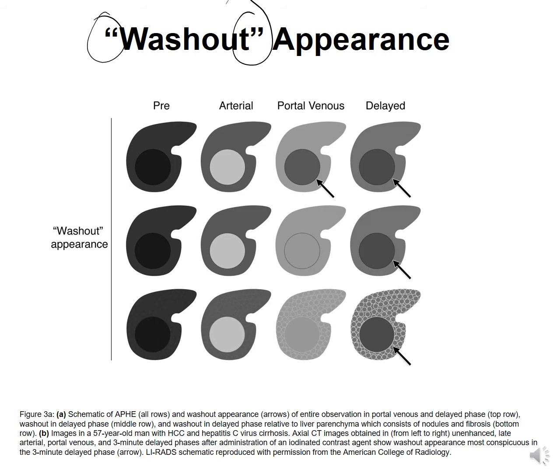The quantitative assessment of washout has shown better sensitivity than qualitative assessment, but this improvement is obtained at the expense of a higher number of false positive findings. A study suggests that a lesion to liver signal intensity ratio of 0.88 on MR imaging correlates most strongly with the reader's visual interpretation of washout.